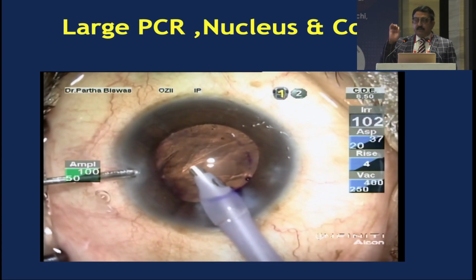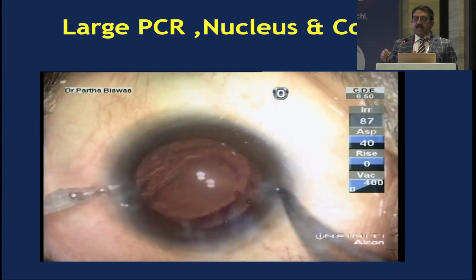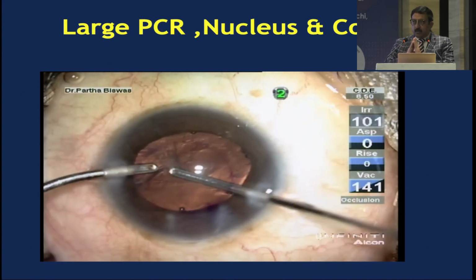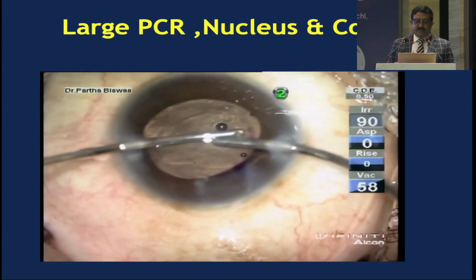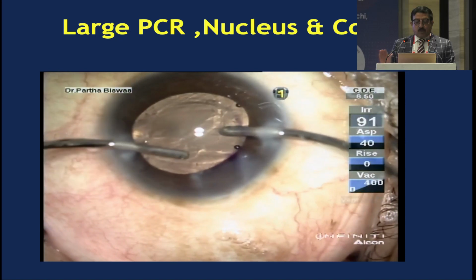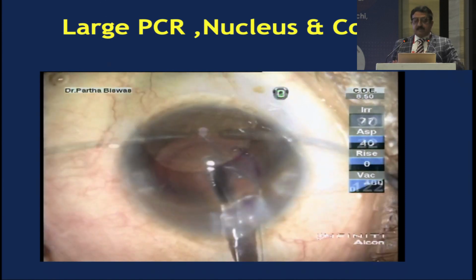Please remember, the moment you feel that vitreous is there, put in a little more additional viscoelastic, stain, do anterior vitrectomy, and get all the vitreous out of the way. Then again, you can go ahead and take off wisps of cortical matter if necessary. Here in this case, vitreous has not shown, so we are able to take off the little bit of cortical matter.